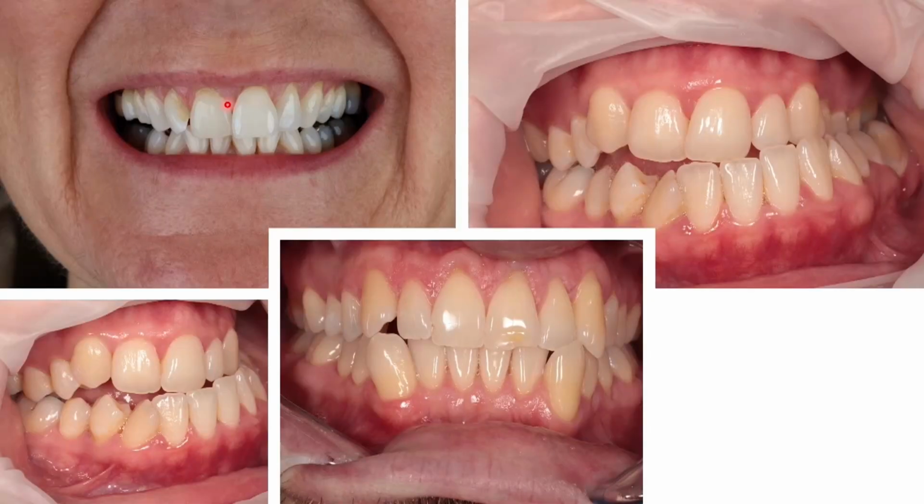The case in the middle then is obviously severely crowded in the lower arch. We've got some cross bites. The canines are both lying in a very unfavorable direction for anything. You can see the roots coming down this direction here and this direction here.